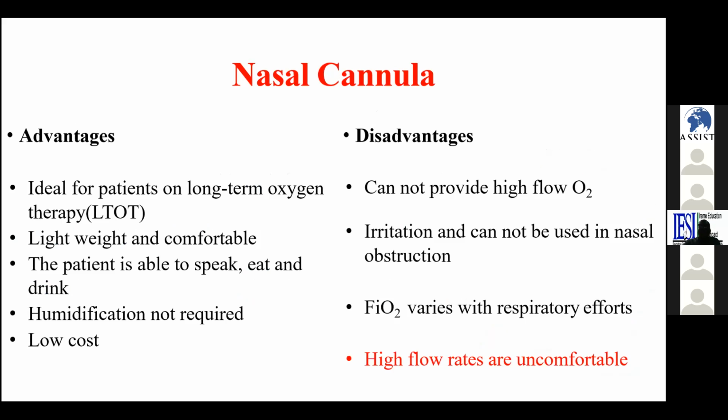So the advantages of a nasal cannula: of course, it's ideal for long-term oxygen therapy. It doesn't need a humidifier, and it's low cost. It keeps the patient comfortable. You can speak, you can eat, and you can even drink. One of the disadvantages of a nasal cannula is that it can't provide high flow.